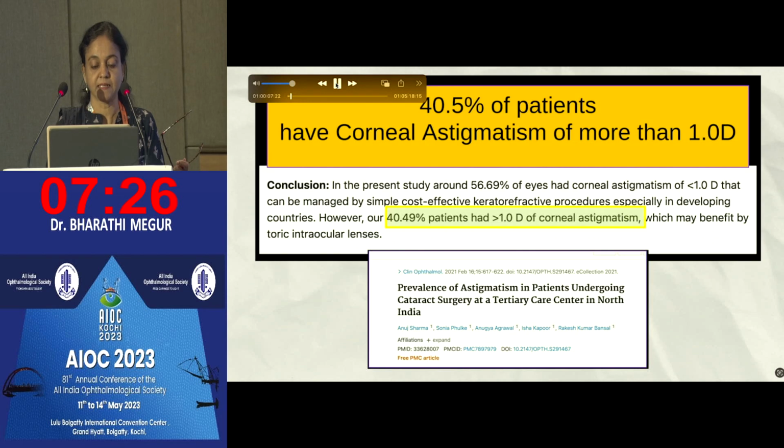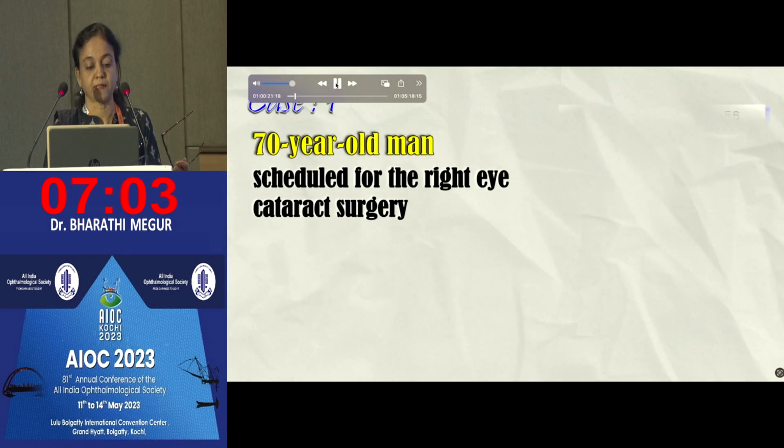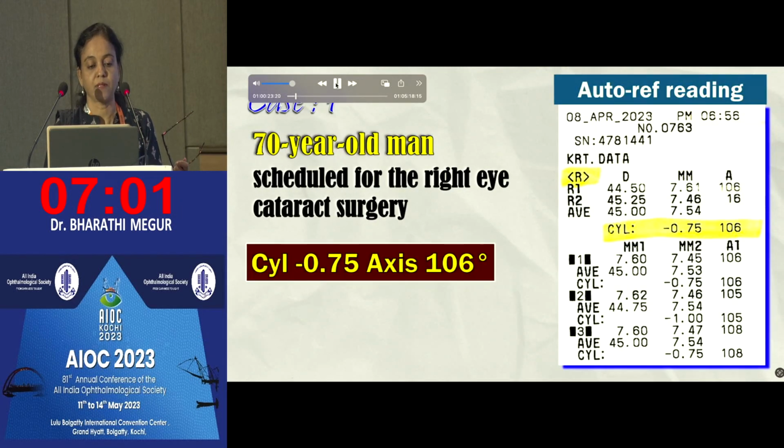As we see, the scale of the problem is that almost 30% of the cataract patients who require surgery would require a toric IOL. This would mean every 2 to 3 patients out of 10 would require a toric IOL. This is justified by all the data and statistics obtained from the journals. At least 30% of our workflow would require a toric IOL.